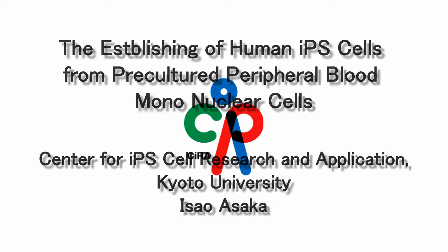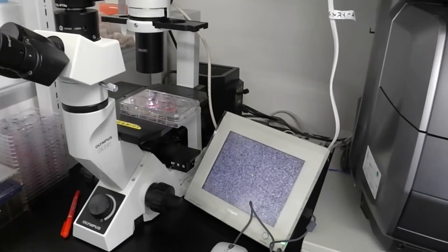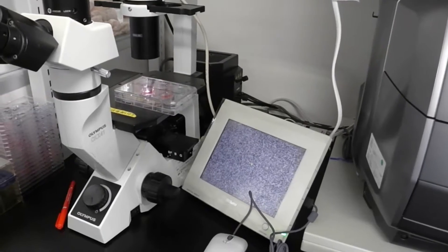This movie demonstrates the establishing method of human iPS cells from pre-cultured peripheral blood mononuclear cells.